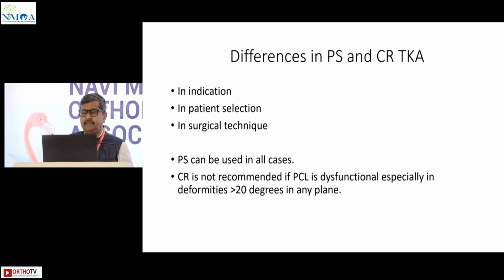Now, differences in PS and CRTK, of course, there are differences in indication, in patient selection, and in surgical technique. Now, PS can be used in all the cases. CR is generally not recommended if the PCL is dysfunctional, especially in deformities more than 20 degrees in any plane. But there are some purists like Dr. Ashok Rajgopal who can do a CR knee even in a fused knee, right? And he says that he has never used PS.